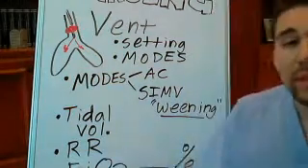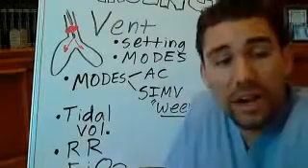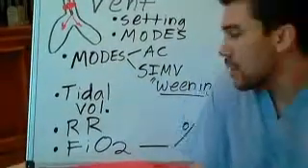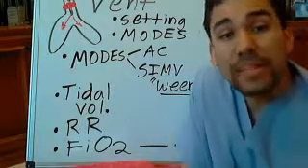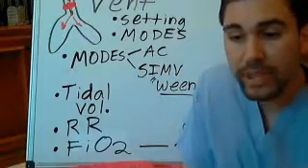You also have something called tidal volume, which is a setting on your ventilator. This tidal volume pushes a certain number of milliliters into the patient's respiratory tracts.